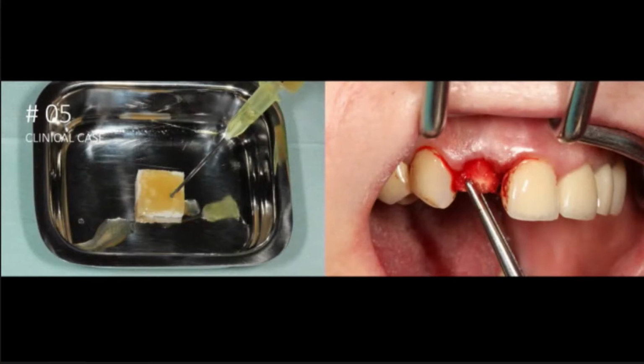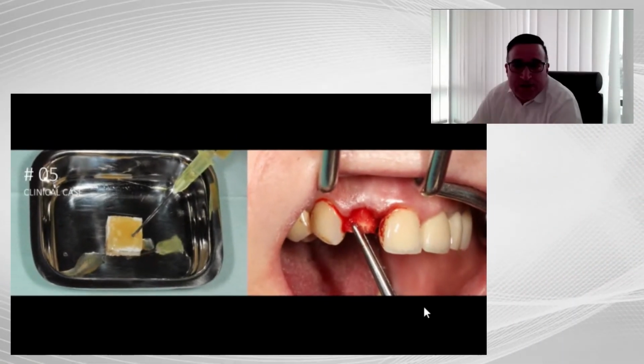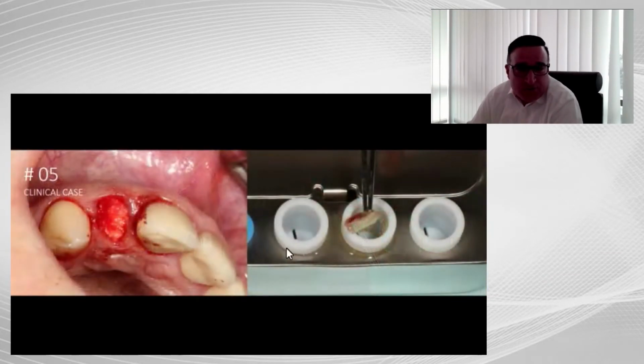Injectable PRF was applied to the CERASORB foam, and you can see how wonderfully the CERASORB foam takes the A-PRF, and the perforation is working here very nicely, and then thereby biologized or biologically activated, placed into the socket with careful pressure.